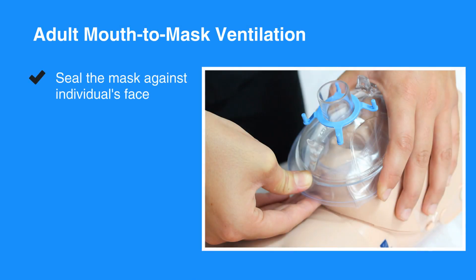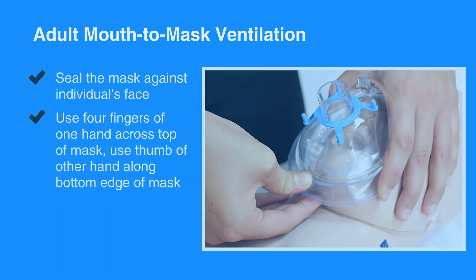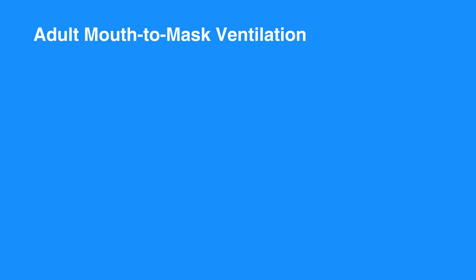Next, seal the mask against the individual's face by placing four fingers of one hand across the top of the mask, and place the thumb of the other hand along the bottom edge of the mask.